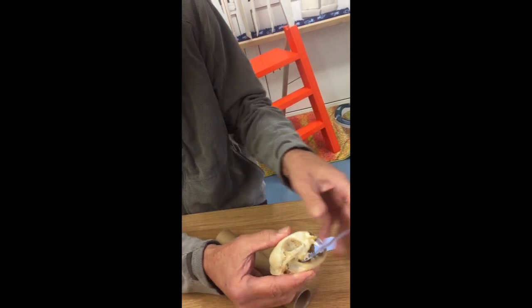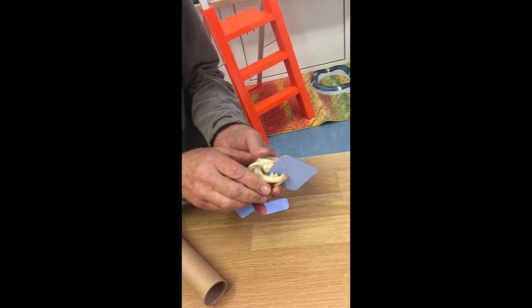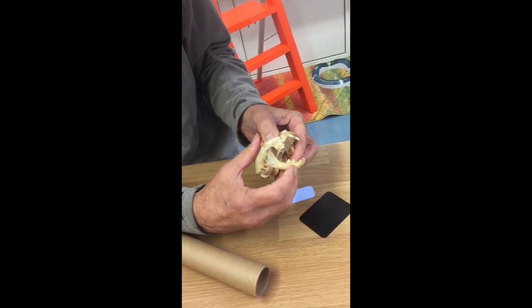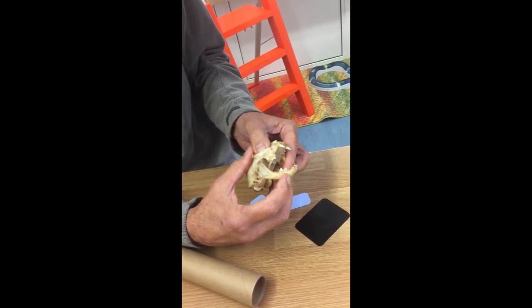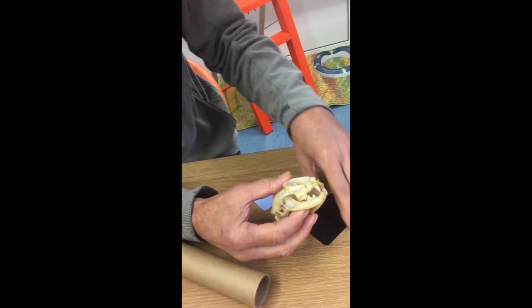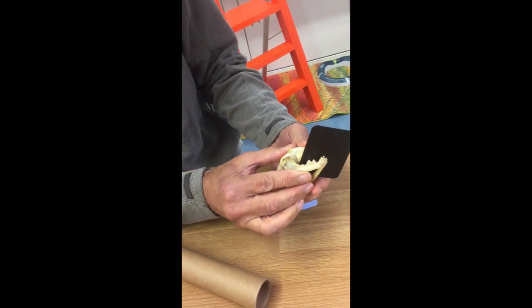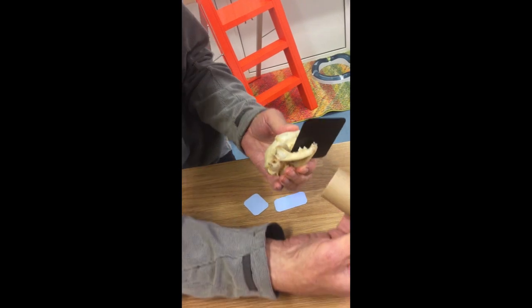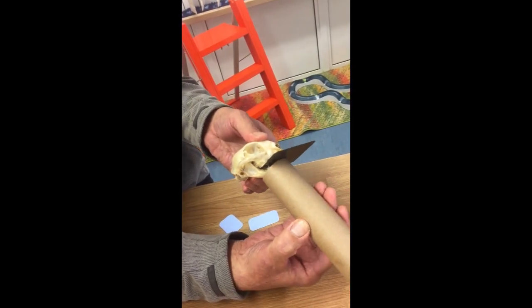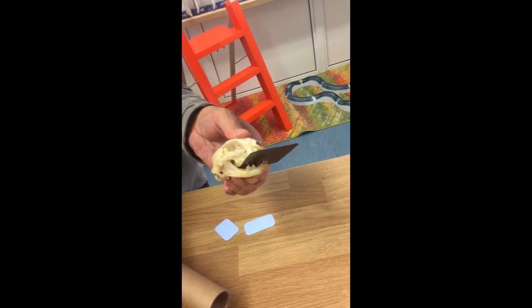So when we then come on to the lower jaw, unfortunately my little puppy has eaten the canine tooth, but the line of the canine tooth, the apex, is somewhere down here, crown is somewhere here. So plate in, so that there gives you the approximate line of the tooth. Bring that down to halve it, tilt it out 15 degrees, take. Job done.